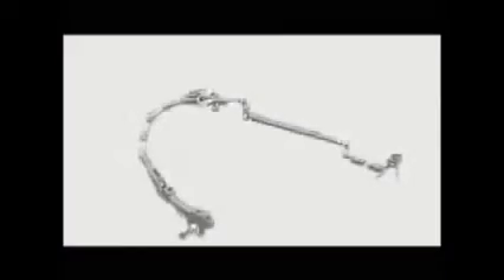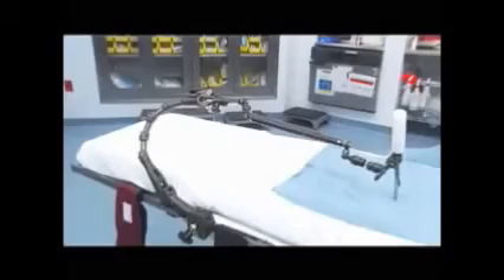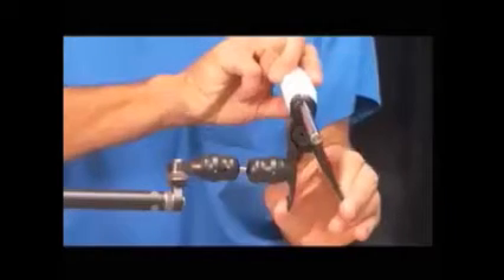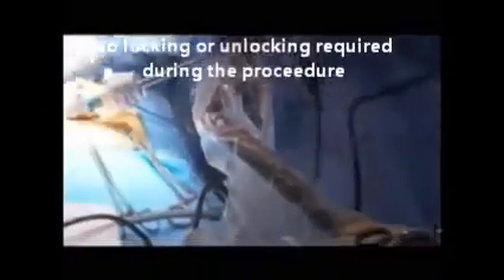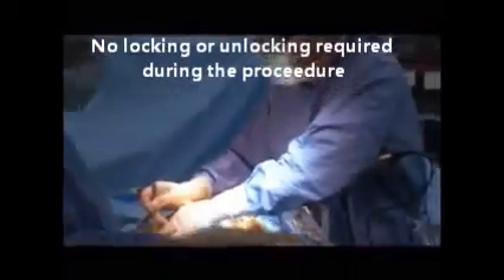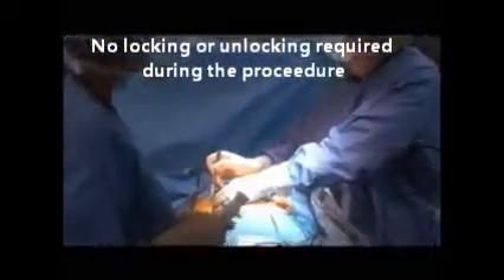The laparostat — a steady extra hand for laparoscopic procedures. The laparostat holds 5 or 10 millimeter laparoscopic instruments without special attachments, providing a still image. The device allows quick and accurate manual positioning without wasted movements for locking or unlocking.